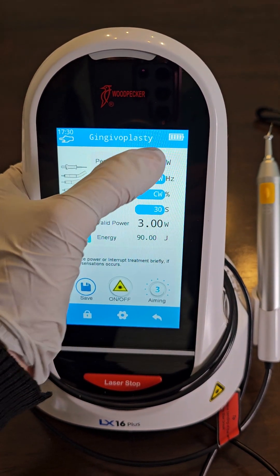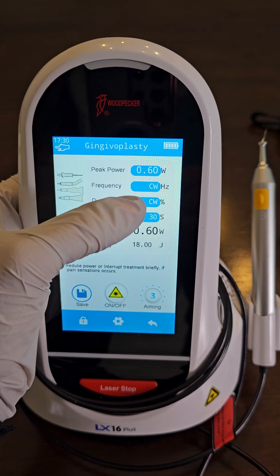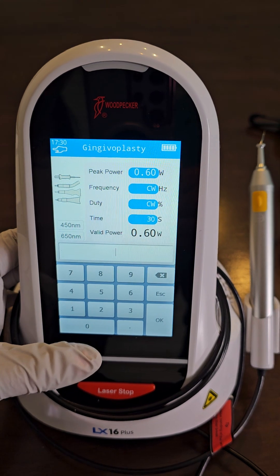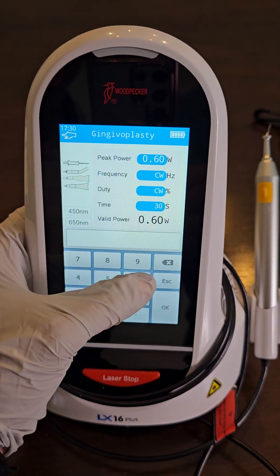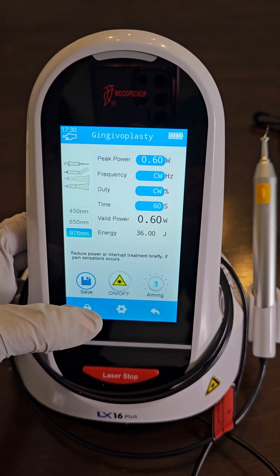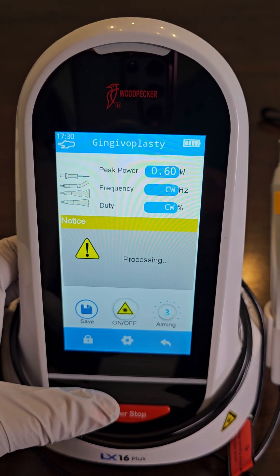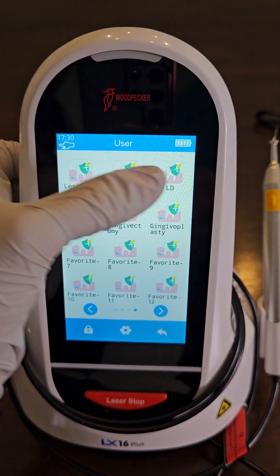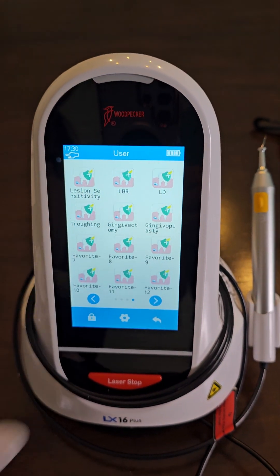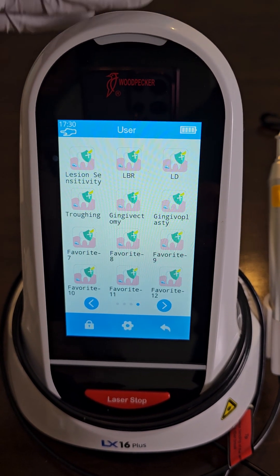For gingivalplasty, save that name. Toggle the power down to 0.6, continuous wave, on the 976 wavelength. Timing can be whatever you want — you could change this to 60 seconds, which means the laser will stop and you'll have to lift your finger off the switch and press it again. Press save. Now whenever we log in we have all our favorite settings. You have 12 favorite options — and this is how to set up the settings for the woodpecker laser.